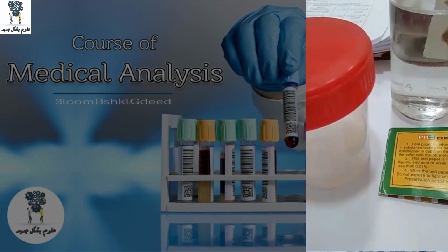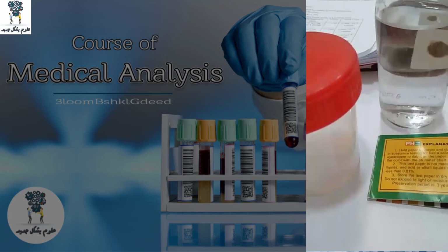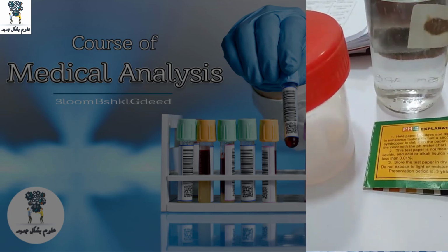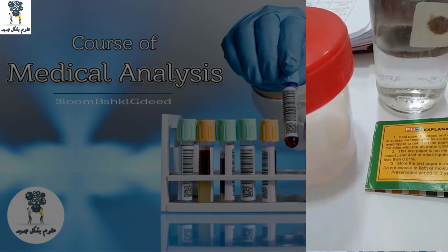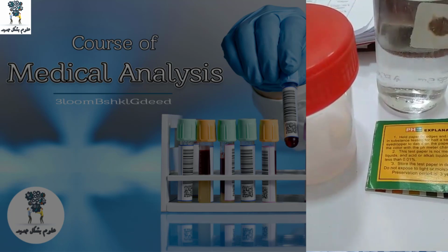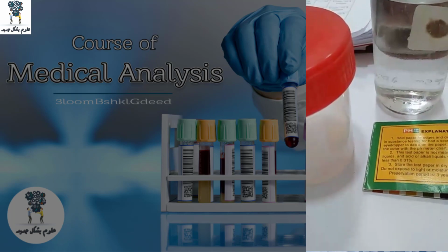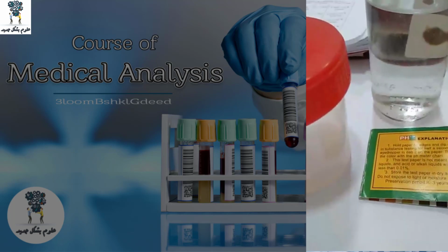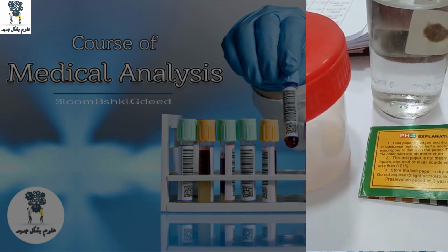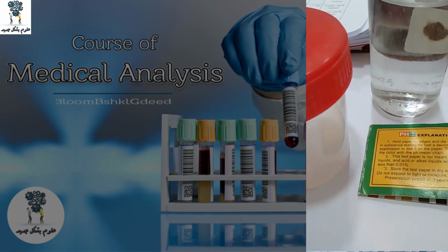What will we do in the next case? The next case is when there really are sperms, and there is something called agglutination. What is the meaning of agglutination? It is a gathering of sperms together, and maybe they are live, or they are immotile.